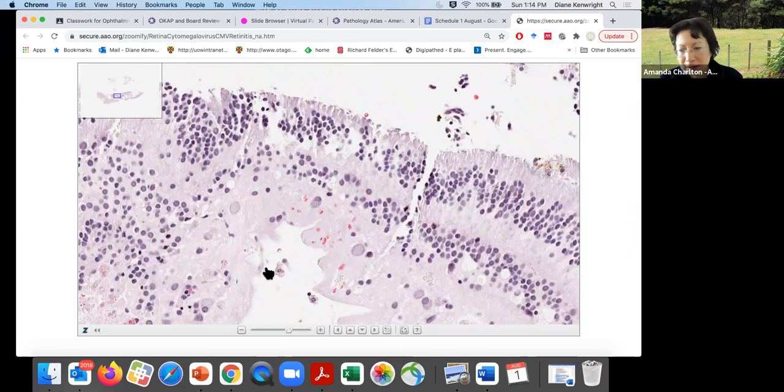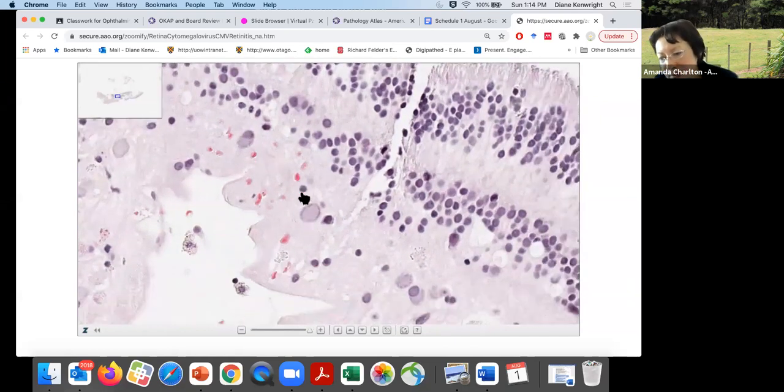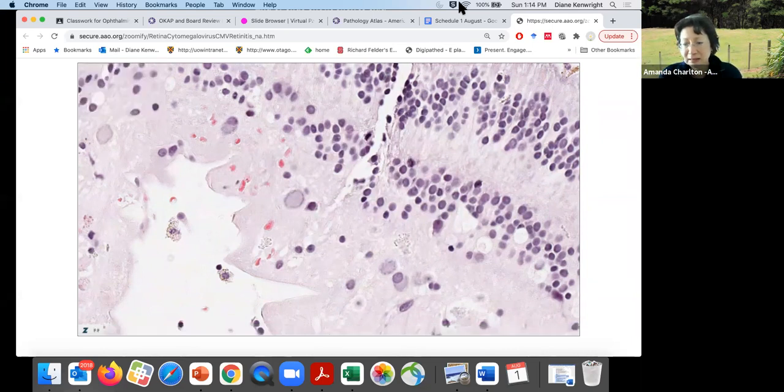I'd have to come a little bit closer and have a look at what they are. Sometimes it can be hard to find things, but oh my God. So the one just by the cursor I'm pointing to, I see it's an oval structure. It kind of has a chromatin pattern of a nucleus to me, and all the chromatin has been distributed around the outside. So there's marginal distribution of the chromatin.